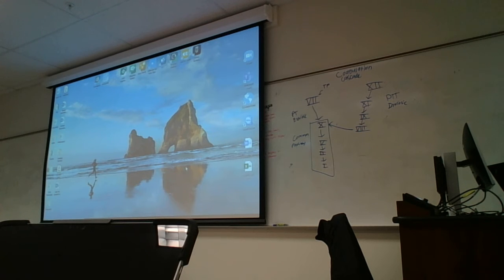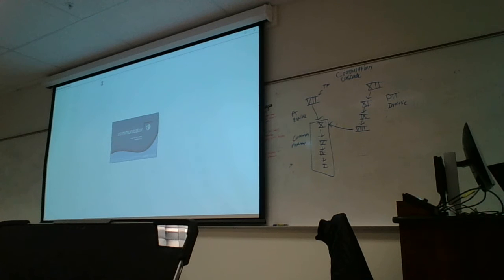So our software you can download for free as a trial version for 30 days, so if you have clients to try it with, you get a full functioning software that you can access. If you're a speech therapist that has an ASHA number, with your ASHA number you are able to create a My Tobii Dynavox account. And then you're able to have full access to our software for as long as you have your ASHA number. The reason why we did that is so that you as SLPs have access to our software to be able to try with clients.